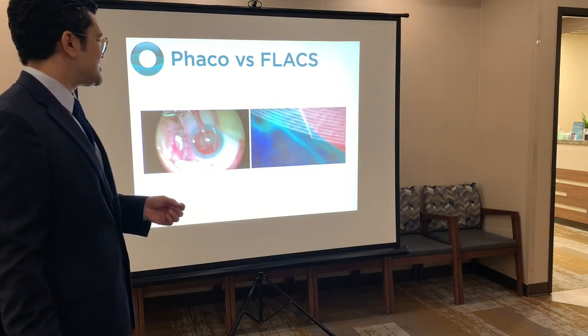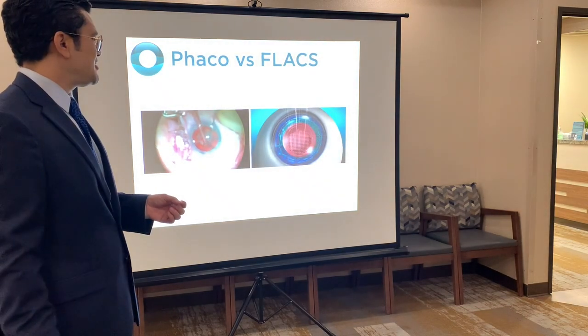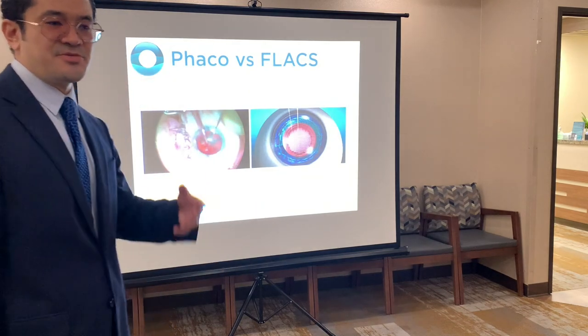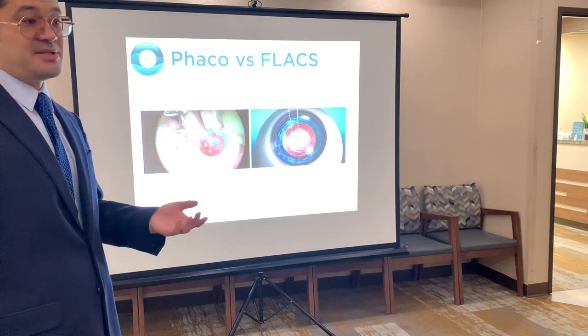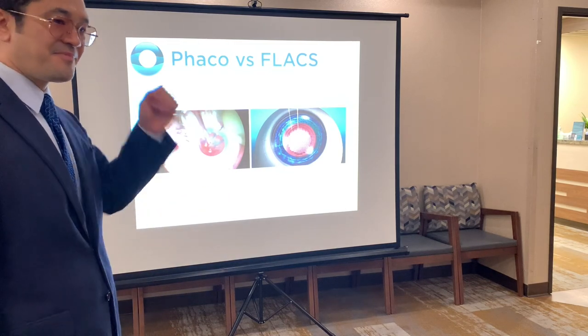It's creating these shock waves to break apart the tissue. And then you can use the laser to also break up the cataract into smaller fragments. Then it's very easy to remove. So two different methods. When people ask, well, what's the difference? I mean, we're doing the same step, but one is the computer's doing it. One is we're doing it by hand.